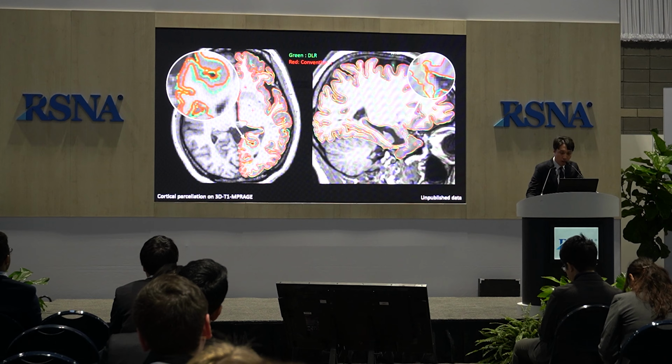Diagnostic MRI has shown a major breakthrough from the 2000s with the introduction of 3 Tesla MRI, and in 2018, the 7 Tesla scanner was approved for clinical use, but its use has been quite limited to mostly very narrow neurodegenerative diseases. So there seems to be a gap between 3 Tesla and 7 Tesla scanners, which I think can be filled by the deep learning reconstruction technique that's become widely available from 2020.